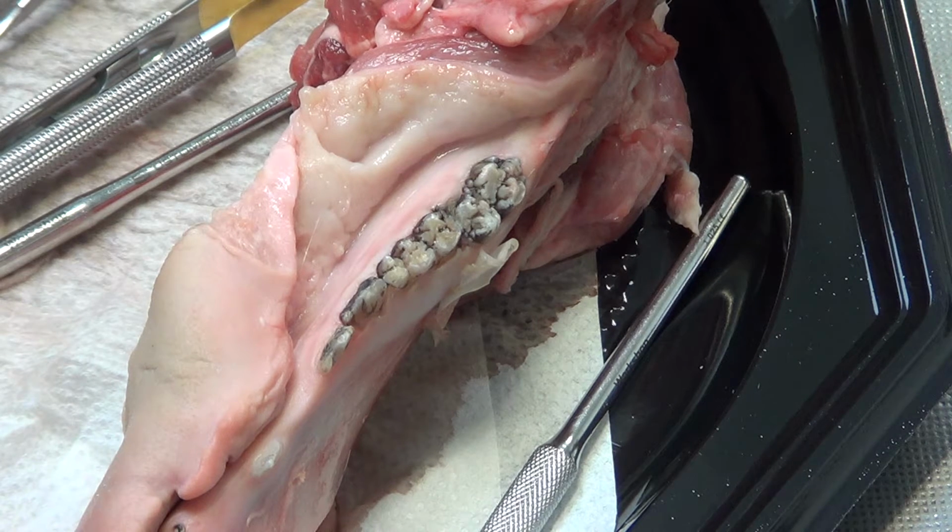The blade is going parallel to the bone, and if you pull the cheek of the pig, you can see that the movement of the alveolar mucosa is going a little bit apically, because remember, we want to obtain this free space in which we will put the epithelial connective tissue.